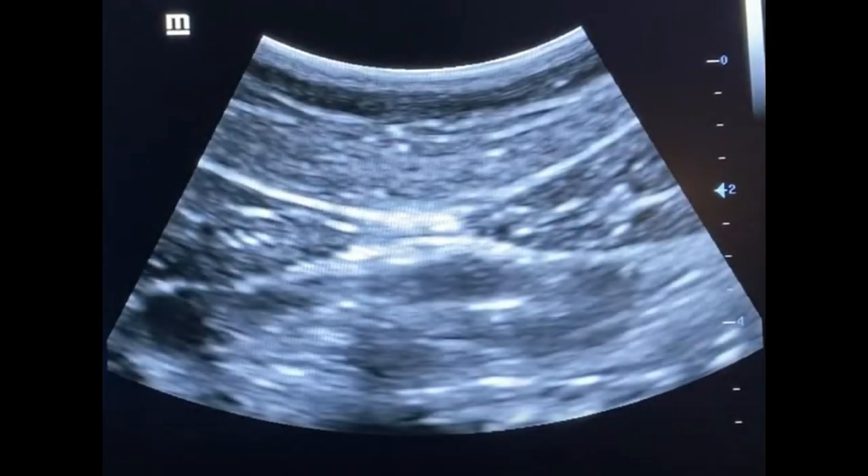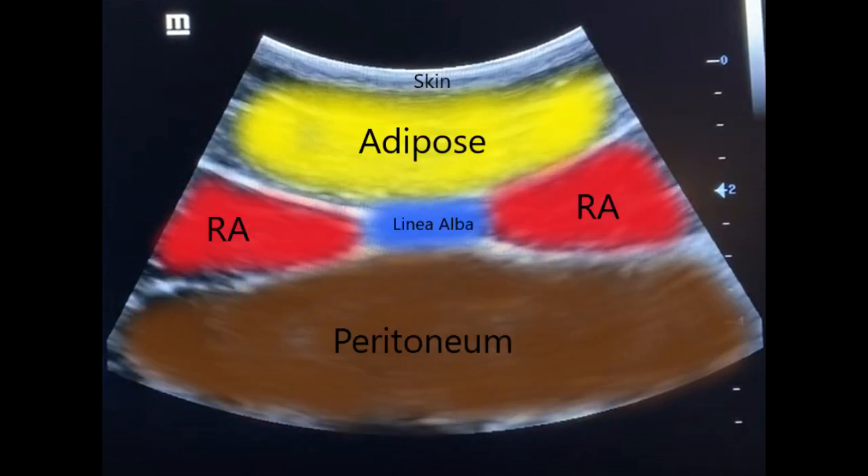Here's a still image of kind of the center of the rectus. You see the linea alba, and now you should start to be able to make these layers out. So again: the skin at the top, the adipose, the linea alba in the middle, both sides of the rectus on each side of the linea alba, and then the peritoneum underneath. Hopefully that makes a little more sense as to what those layers look like.